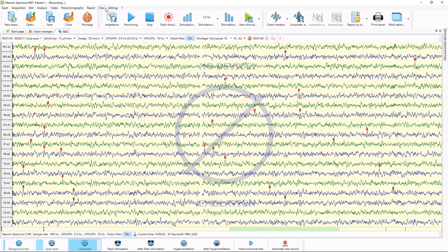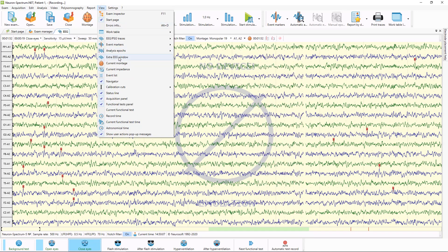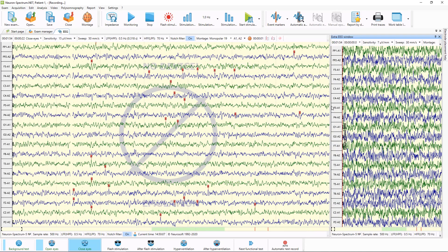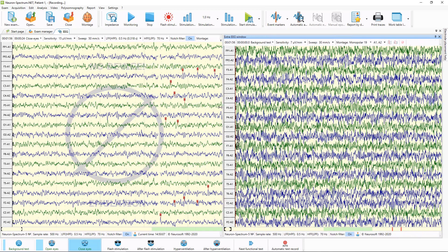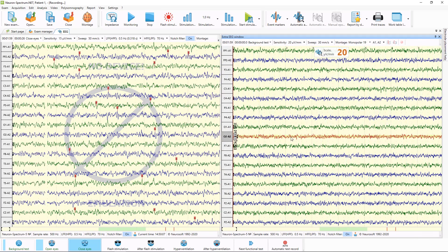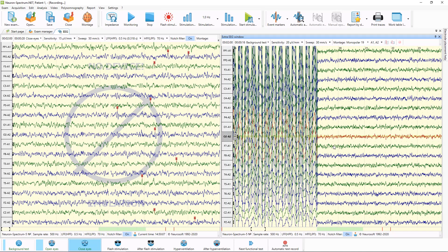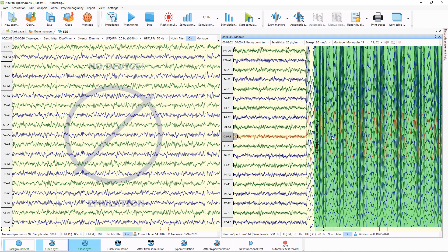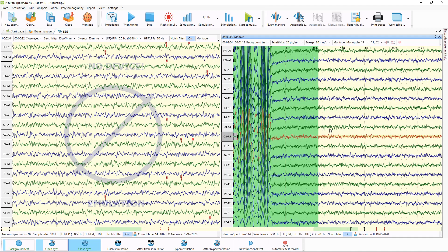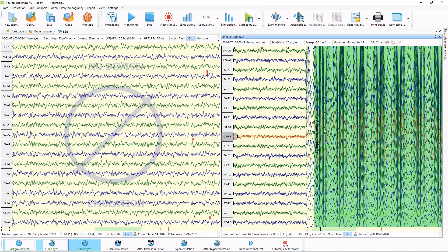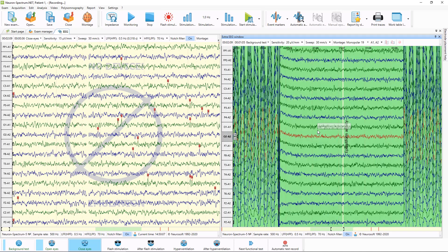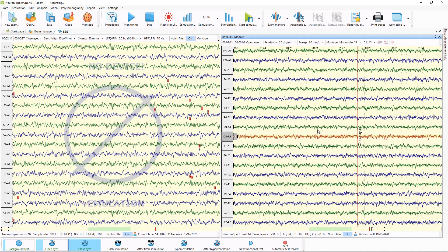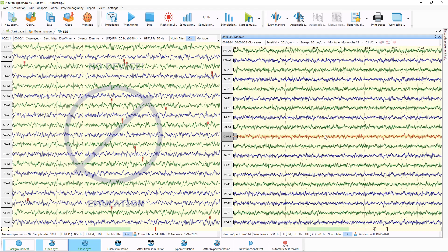During the acquisition, using the extra EEG window, you can review already recorded part of the traces. You can scroll the traces with mouse wheel. You can see it's epileptiform activity, which was marked automatically by the software. This is our functional tests, open and close eyes.